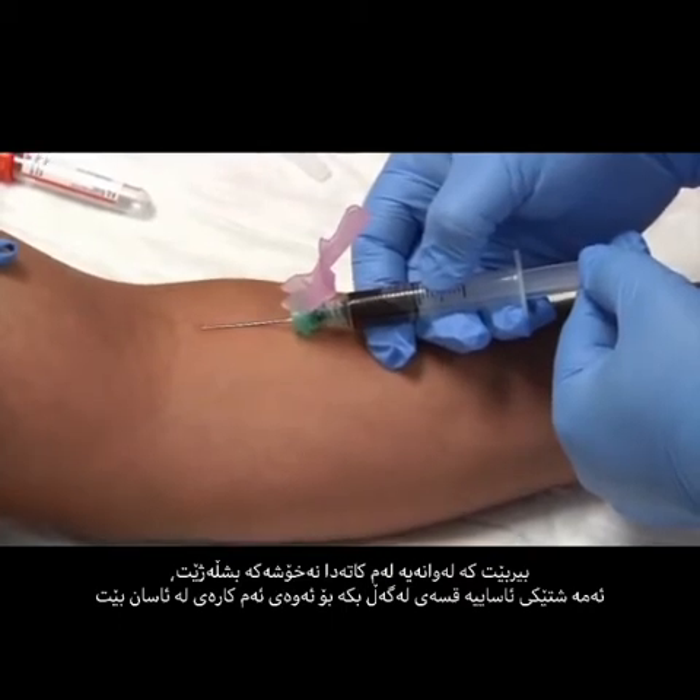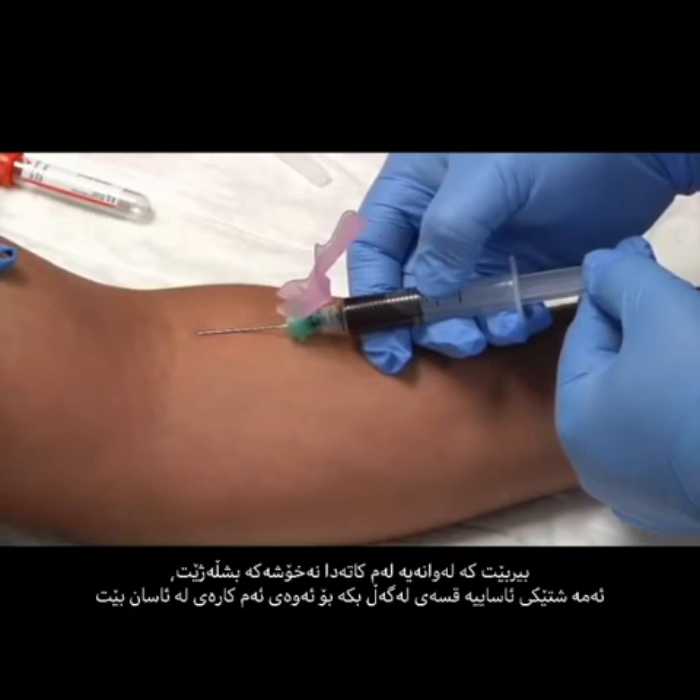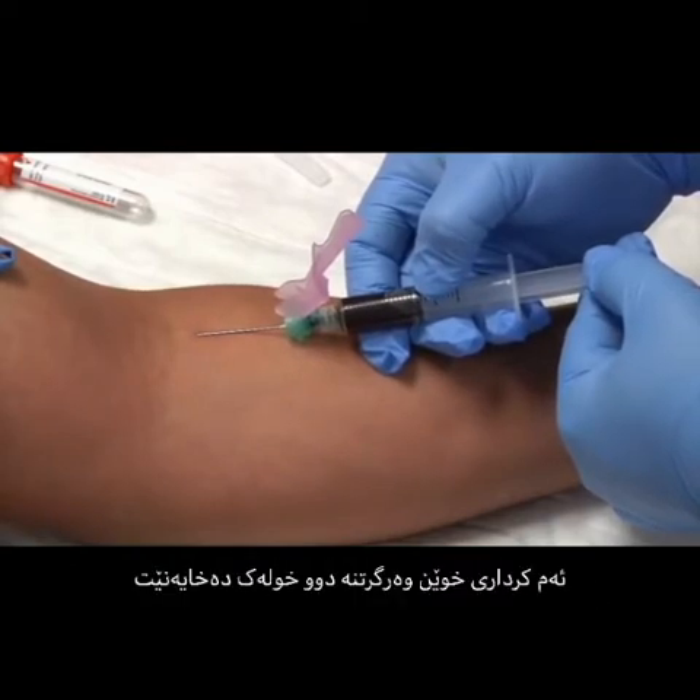As we're doing this, keep in mind your patient may be nervous. It's okay to talk to your patient — it will probably put them at ease. This could take a couple of minutes to draw the amount of blood you need.